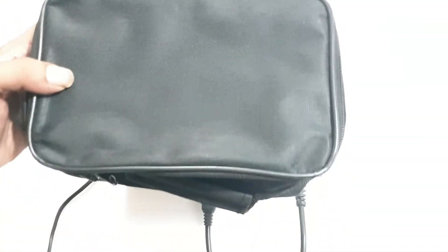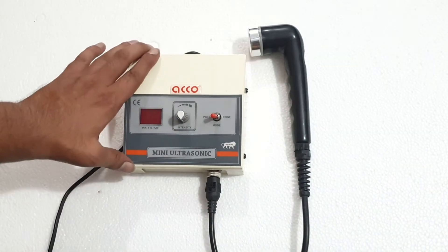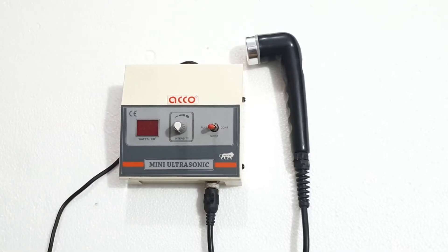It comes with a carry bag, gel bottle, handle and wire, and a machine. Let's start the demo now.